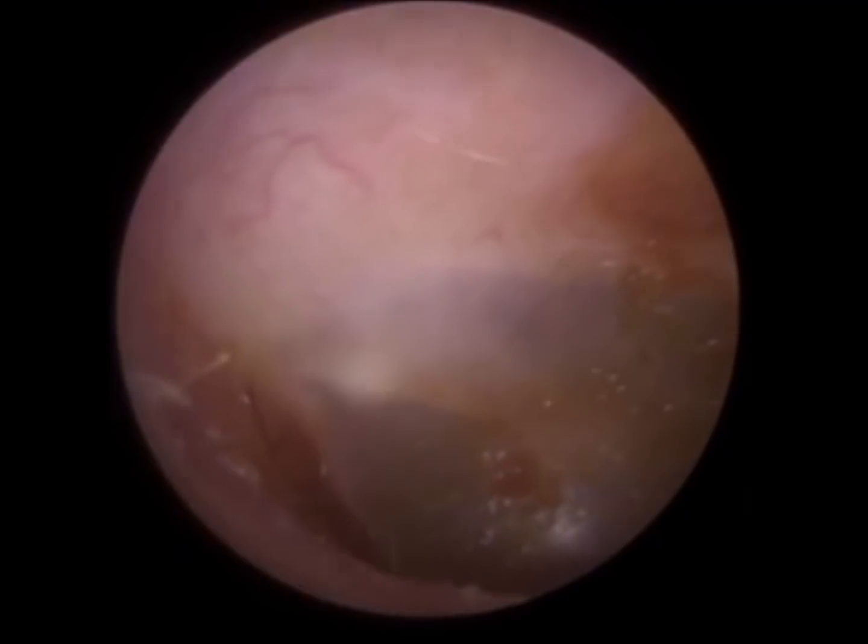There's the tympanic membrane, because the wax was quite sticky and it was fully occluding. You can see there's a bit of staining on the eardrum there. We leave that, that's fine.